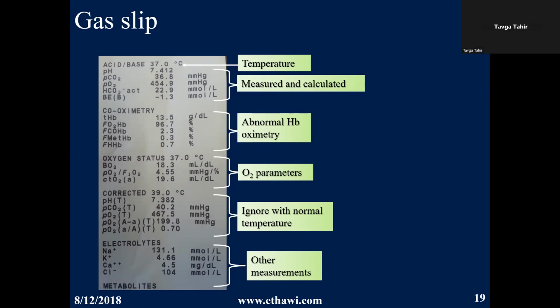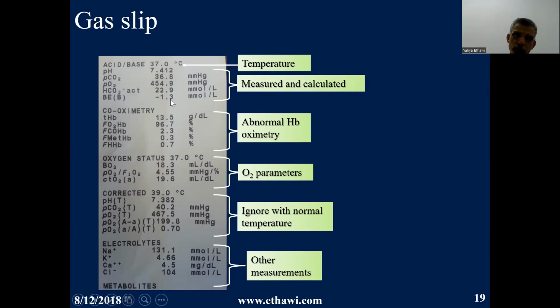Okay. The first few lines are actually either the calculated or the measured value. Remember, we said that the bicarb is calculated, but sometimes you find this actual. This is measured, not calculated.